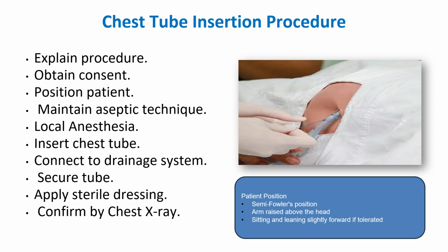First and foremost is explaining the procedure to the patient. Very important word. We have been learning this word, but many of the time we may fail to follow this. So always you need to explain the procedure to the patient, though it is being performed by you or the doctor. You have to prepare them mentally in all aspects so that he will cooperate with you very well. So you have to explain the procedure: madam or sir, some sort of tube will be inserted to you by the doctor in your chest cavity. Since you have breathing difficulty, since you have excessive accumulation of fluid, we need to aspirate it. All those explanations you have to give to the patient.